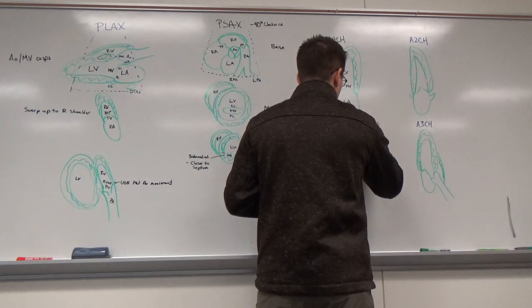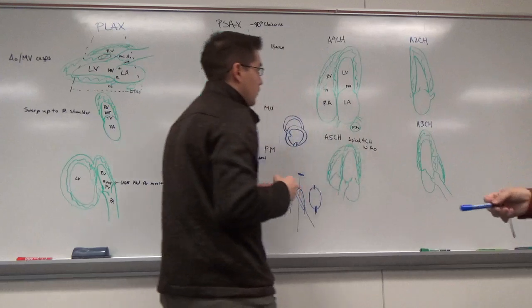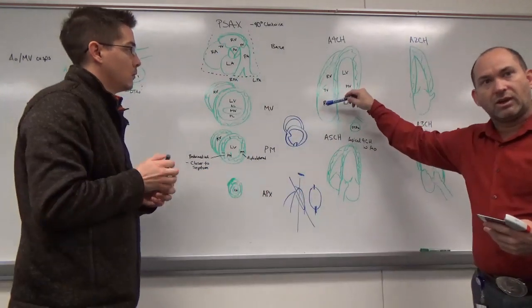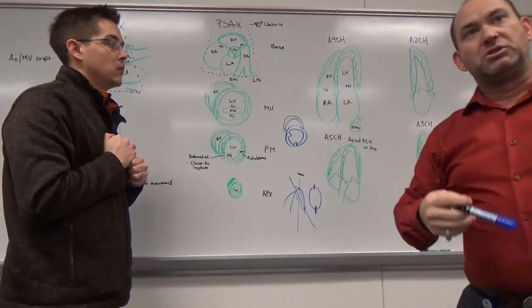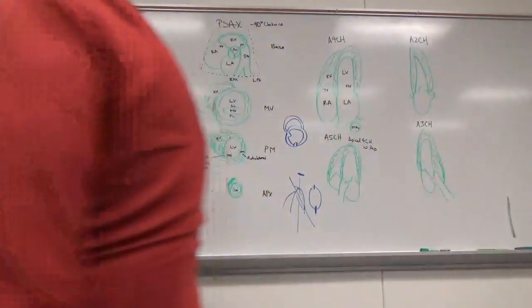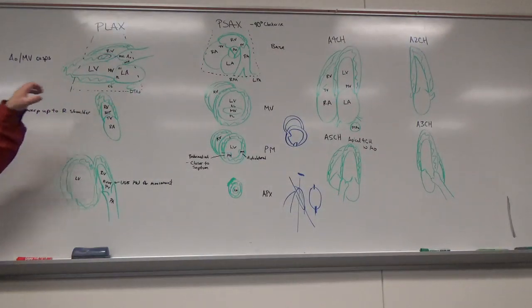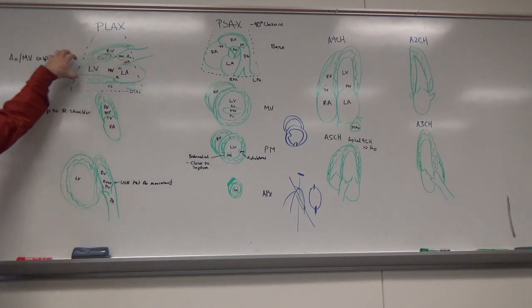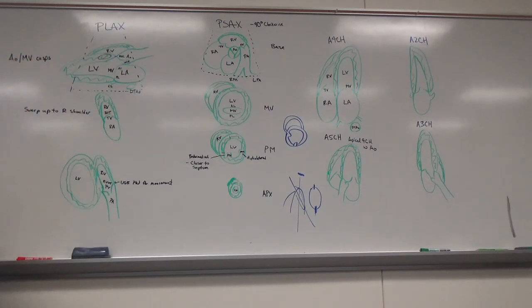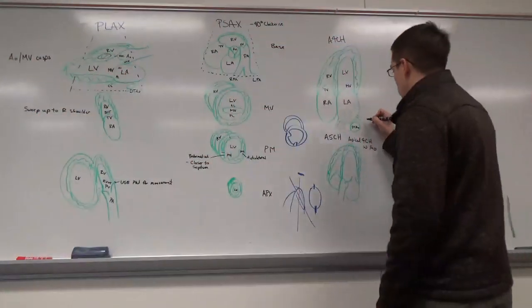So often we see that when people go to the 4-chamber right away, you can see it's backwards because the RV and stuff is smaller than the LV, but it's on the wrong side of my image, which is the correct side for the Mayo Clinic method, by the way. Or I'm on parasternal view and you're fighting that view. It's like, why can't I get these valves and stuff in? Why can't I get the aorta open? Well, because your ventricle's over here and your aorta's over here. It means you're twisted around, your transducer's backwards, or it got flipped on the screen for some reason.